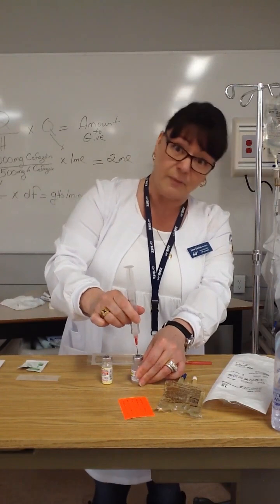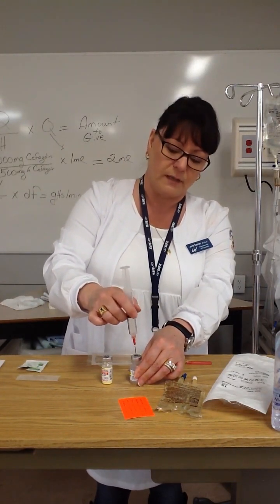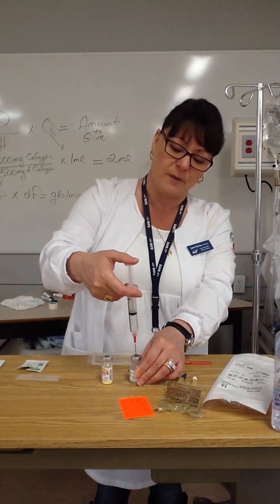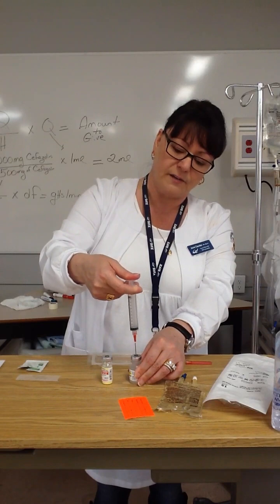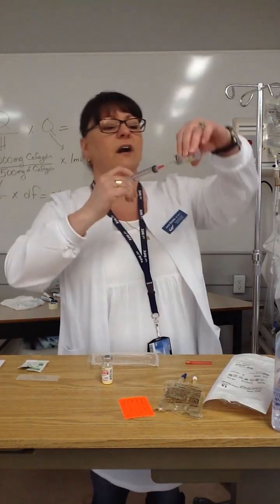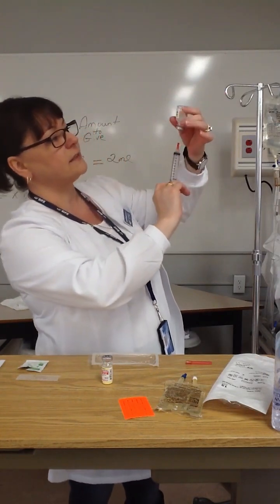I'm going to keep the needle above the fluid. We try not to inject air bubbles into our fluid or into our solutions. My thumb is my powerhouse, so it comes up to the top, and I'm going to insert that air. And then while I have it all in my hand, I'm going to invert the vial, switch my hand around. I'm going to show you that window.